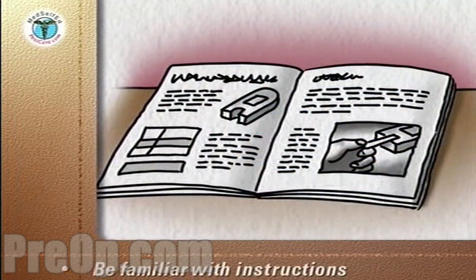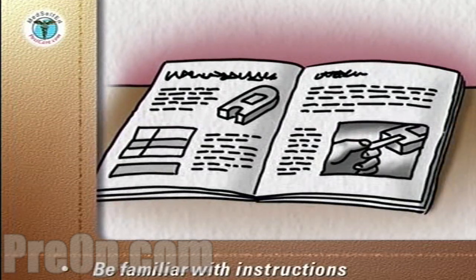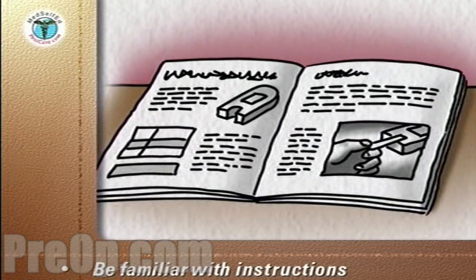You will need to be familiar with the manufacturer's instructions for each unit. This program will provide you with general guidelines that apply to all units.